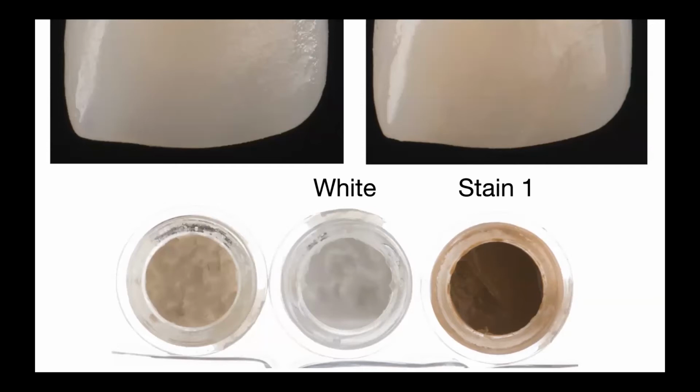As a rule, every system of stains includes shade stains. In the Dentsply Sirona system, they have the name body stains. And the first piece of advice: we can influence the translucency of our monolithic restorations. Sometimes this translucency is too high, and we can see that our stump is visible. It's obvious if we look at the left picture. But if we mix the proper body stain with white, we can increase the opacity of this mixture, and we can apply it on the surface of our monolithic restoration and mask this segment to avoid the lightening effect of the stump.